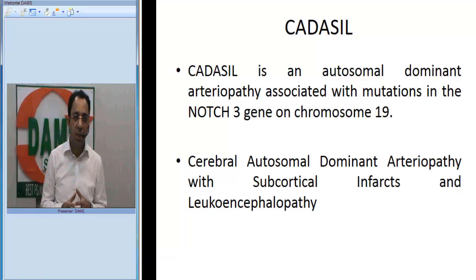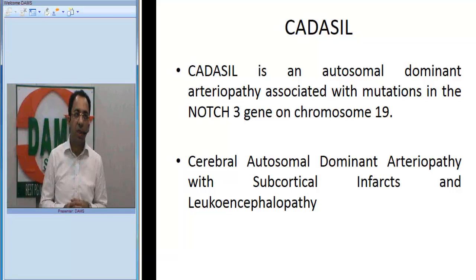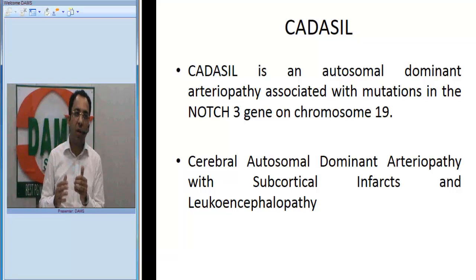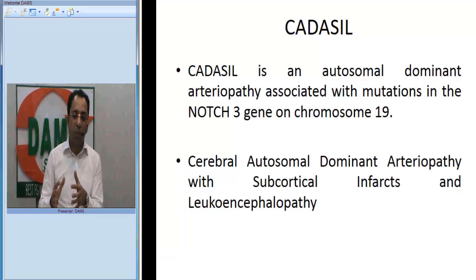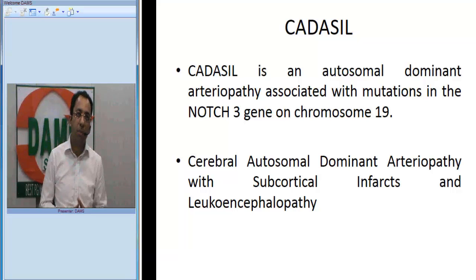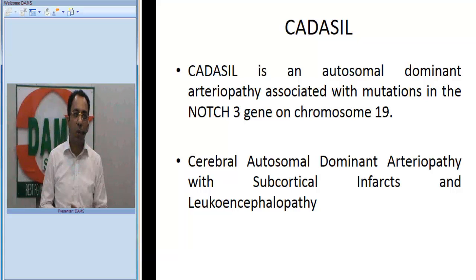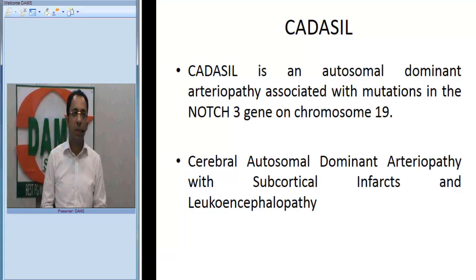These early findings — anterior temporal lobe and external capsule involvement — are very typical for a CADASIL diagnosis, in addition to the white matter changes. The involvement is typically heavier in the frontal lobe compared to the posterior part. That is how we arrive at the diagnosis of CADASIL in this MRI.